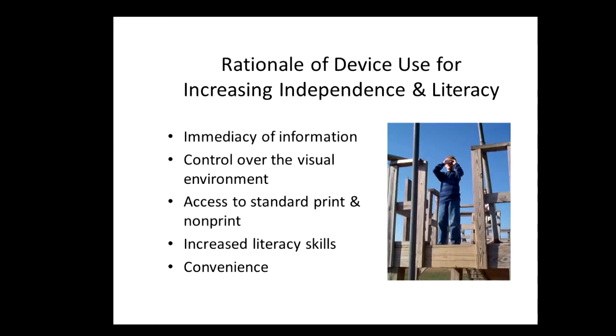Students also, through use of optical devices, this can lead to improved reading performance. Students with low vision typically have far fewer instances of exposure to print than their peers, and this leads to lowered performance in reading. But by using optical devices, they are able to increase that access to print.